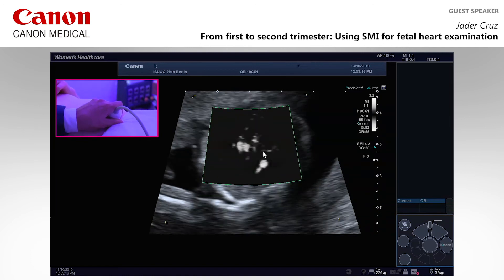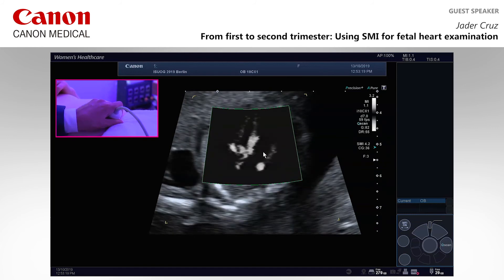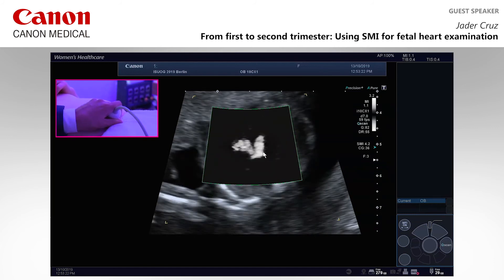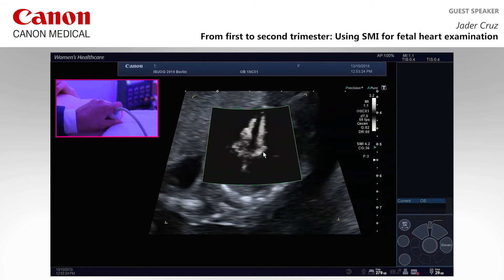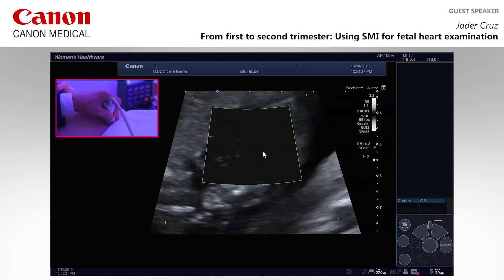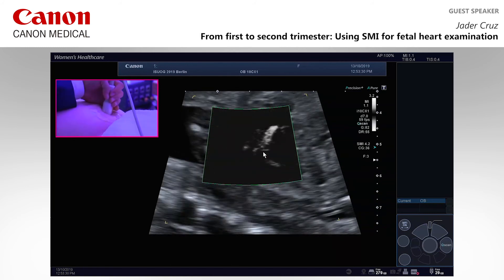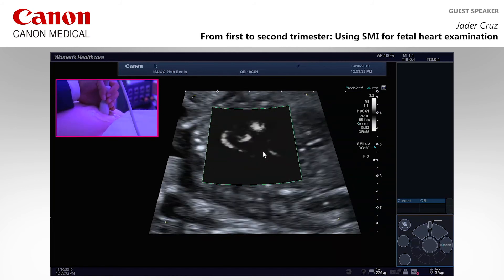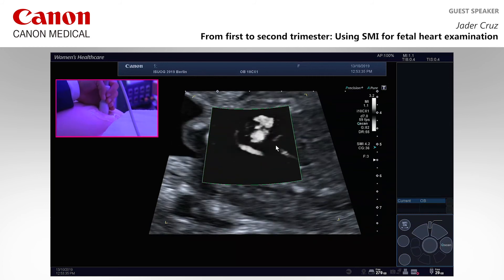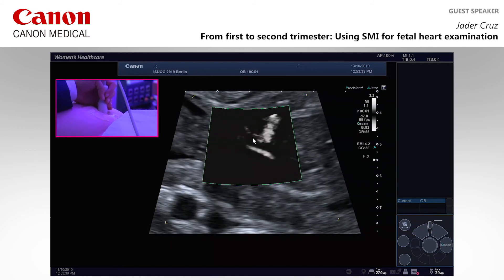The part I want to focus on is exactly this: using high frequency SMI, without doing anything special you can start seeing the pulmonary veins — the return of the pulmonary veins. We still don't have directional information, but you can see them very clearly. You can also explore the inferior vena cava from a different position.